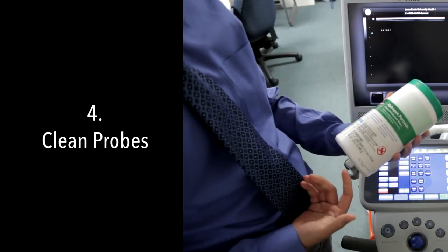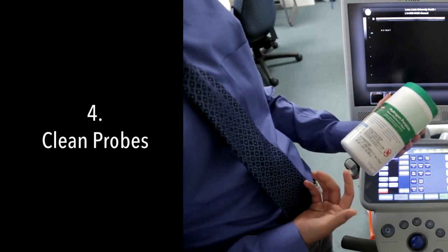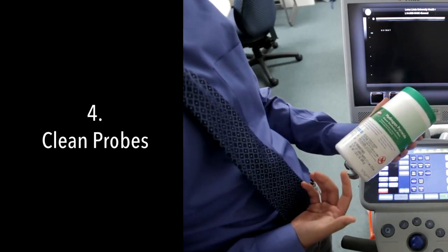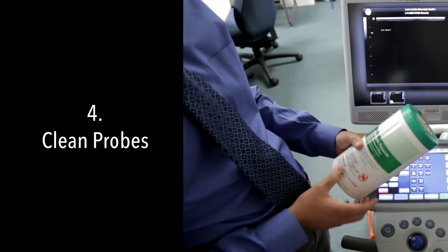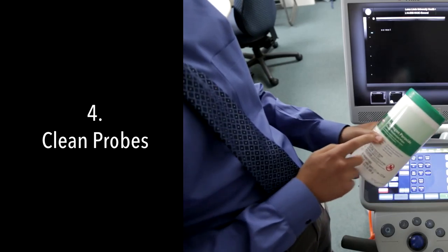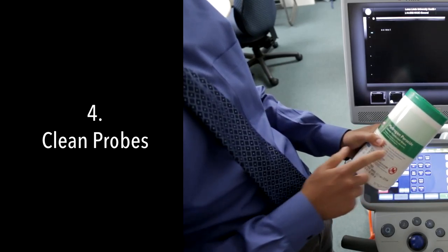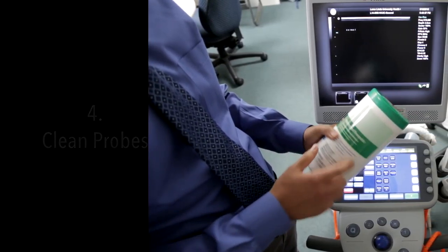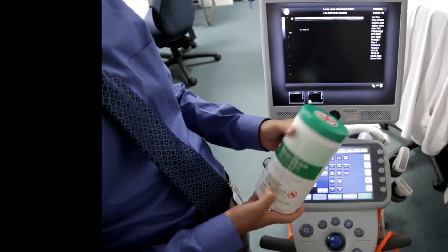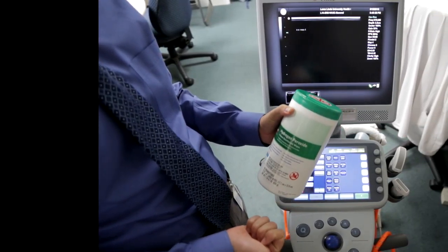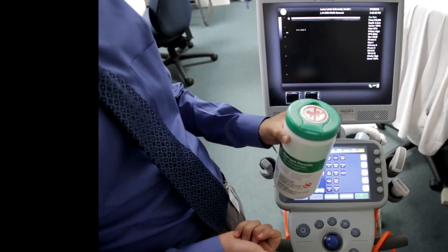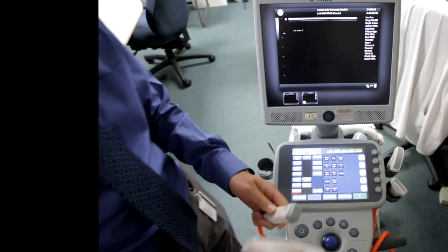Basically anything with a green top will work for cleaning probes. Just look for a green top, either hydrogen peroxide or other disinfectants. Do not use alcohol when cleaning the probes.